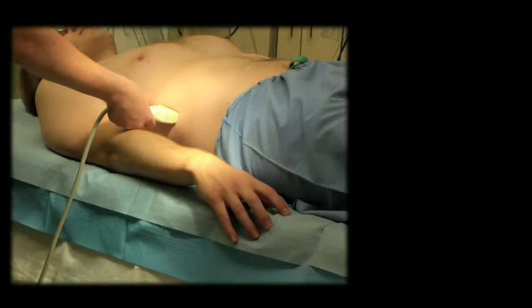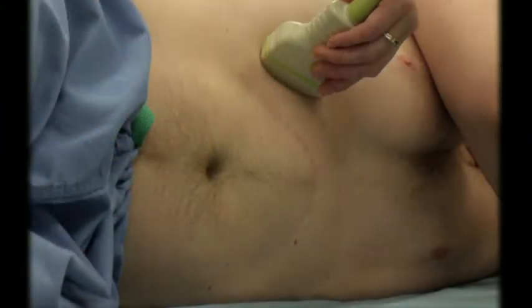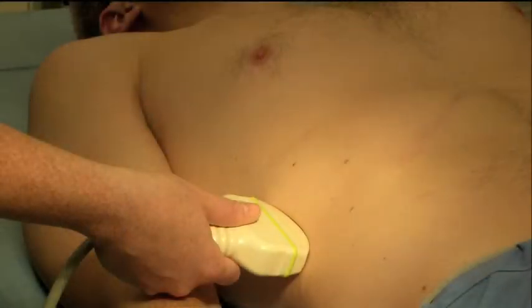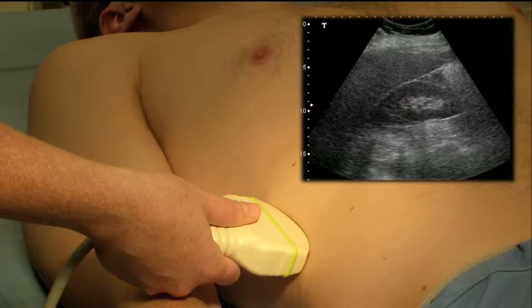The patient should be positioned supine or in the left lateral decubitus position. If unable to get a good view in one position, try the other. Use the abdominal probe or curvilinear probe in a longitudinal position either at the right upper quadrant or starting in Morrison's view, also known as the hepatorenal view from the FAST exam, with the marker aimed cephalad. Starting at Morrison's view may help orient you to surrounding structures and help lead you to the gallbladder.